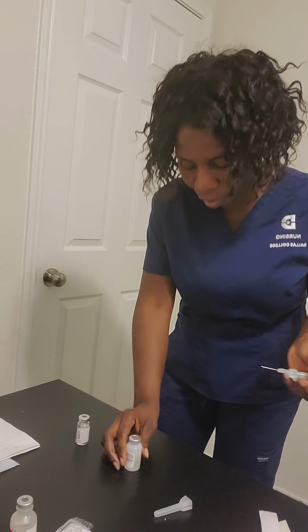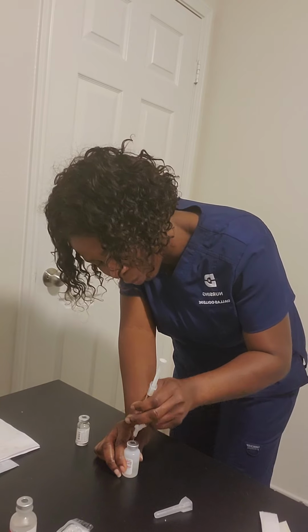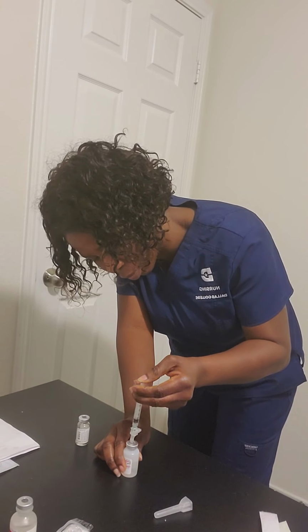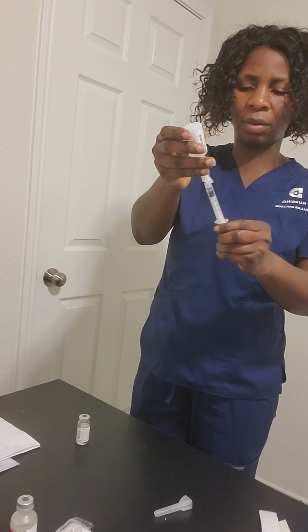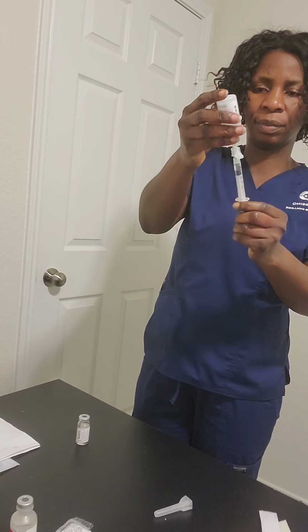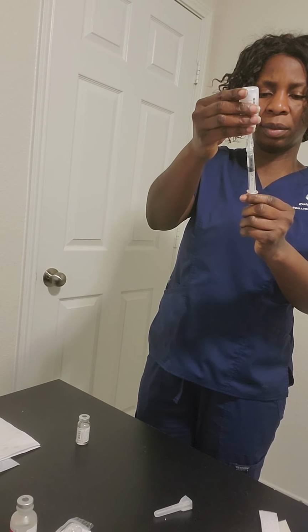This air I'm going to drop into the sterile water, and immediately I'm going to draw 2.5 ml of sterile water.